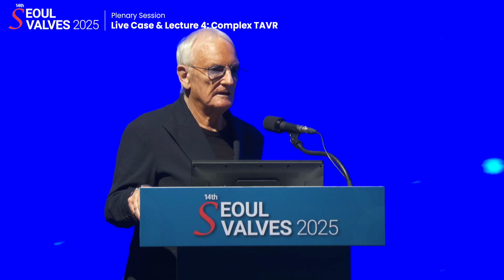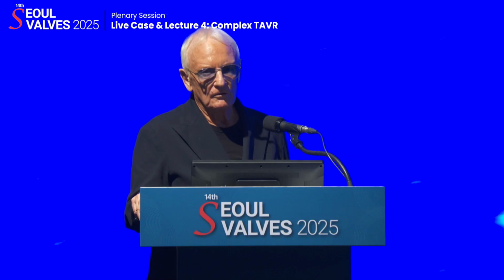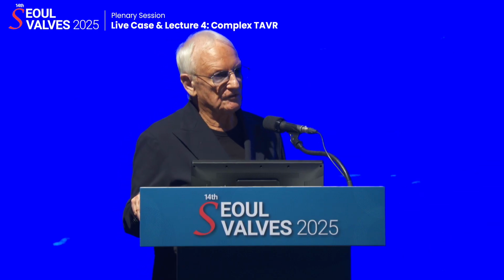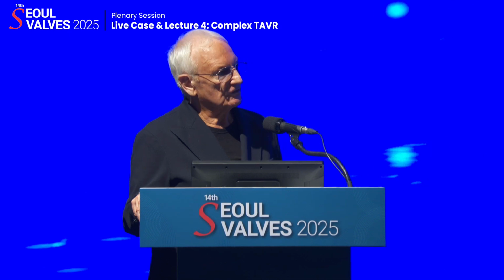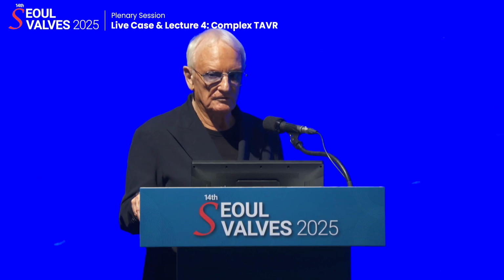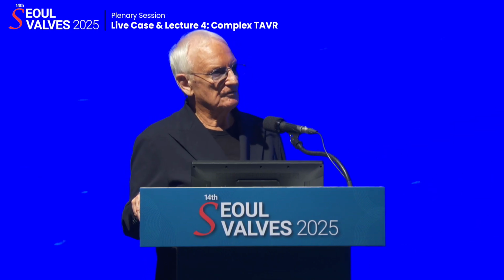Well, we talked about that yesterday already a little bit. And I mean, all the trials do have a MAC registry. I think overall we can be in the replacement scenario. MAC actually, patients with MAC actually work quite well, both Intrepid and EVOQUE, when EVOQUE was used in the mitral space. I think this is something that needs to be studied further.